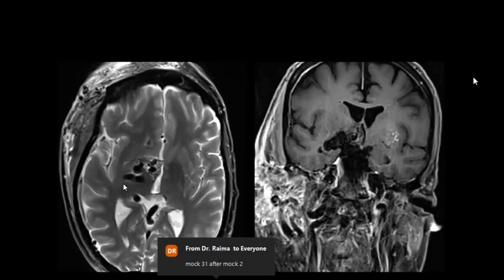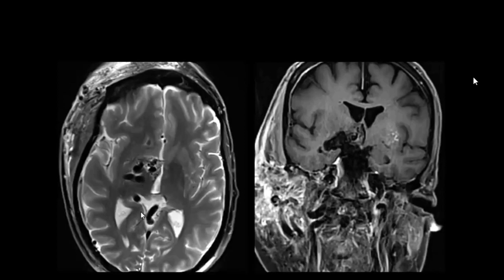Instead of saying abnormal signal intensity, you should say that there are multiple tortuous dilated vessels appearing as areas of signal void. When I listen only to your words and I'm not looking at the images, the region you are describing doesn't come to my mind the way it should. Then there is some thickening in the soft tissues. So what is your thought process?